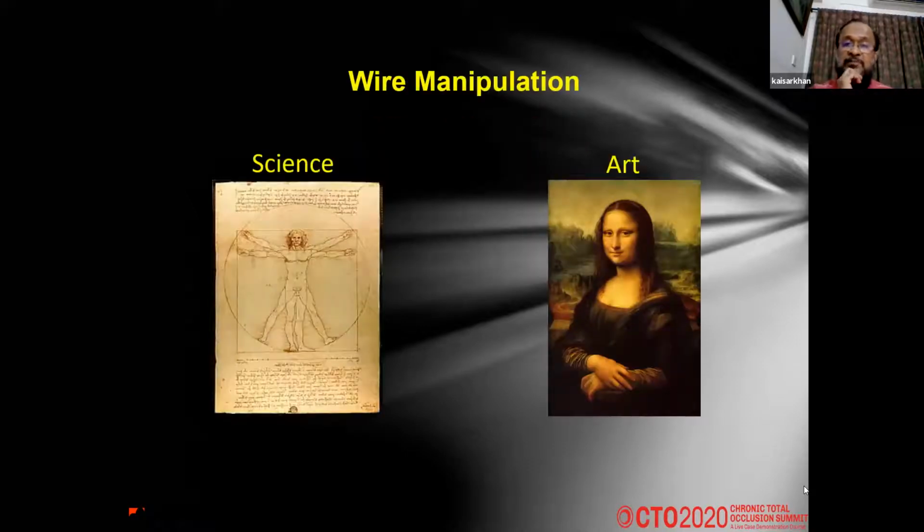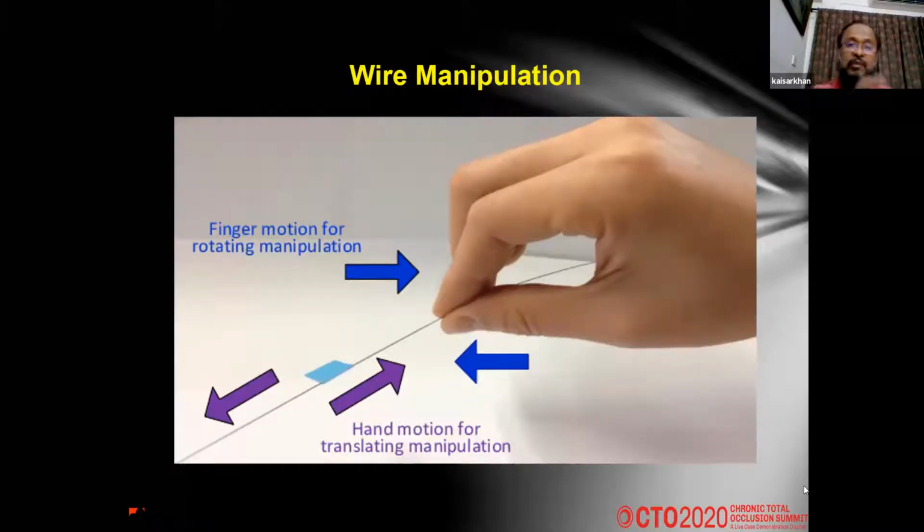And wire manipulation, do it with art and also science. So finger motion, rotation, pull and push, and there is some drilling method, penetration method, sliding method, or push and deflect method.